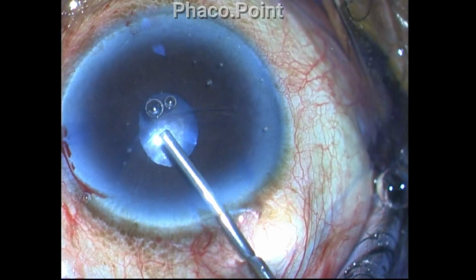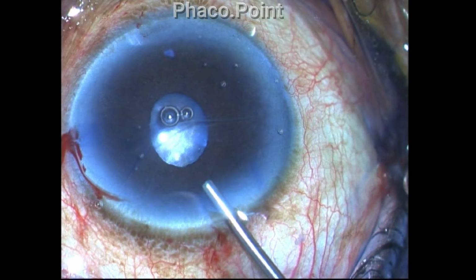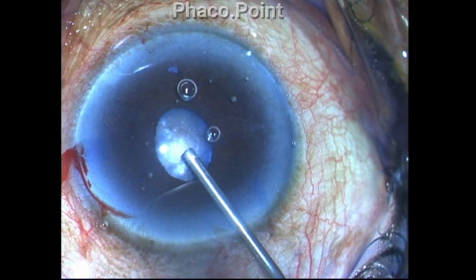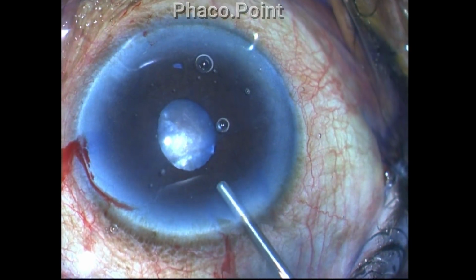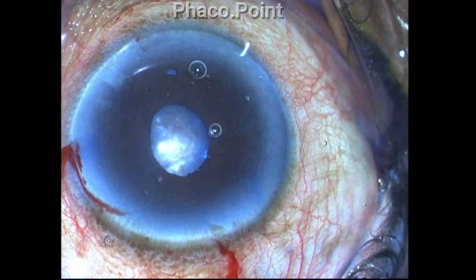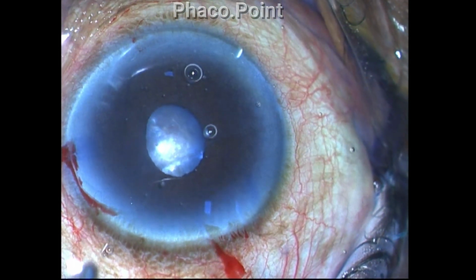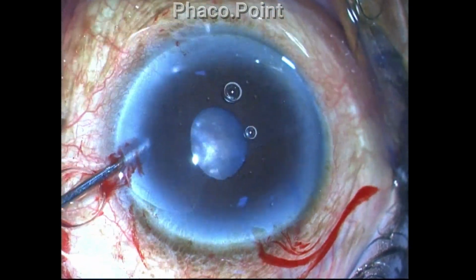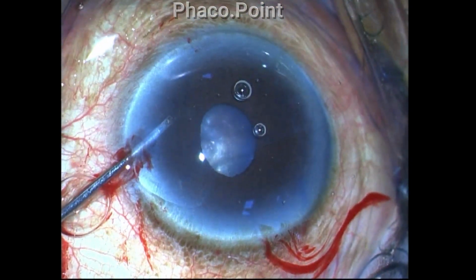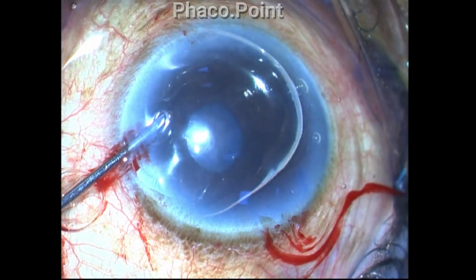A 1/3 or a 30% Descemet membrane detachment occurred immediately, even before the case was started. This simply threw my composure a bit, and I did not know whether I should continue with this case or just put in an air bubble, settle the Descemet membrane detachment, postpone the case, and then take it after a couple of weeks, probably with a small incision cataract surgery.